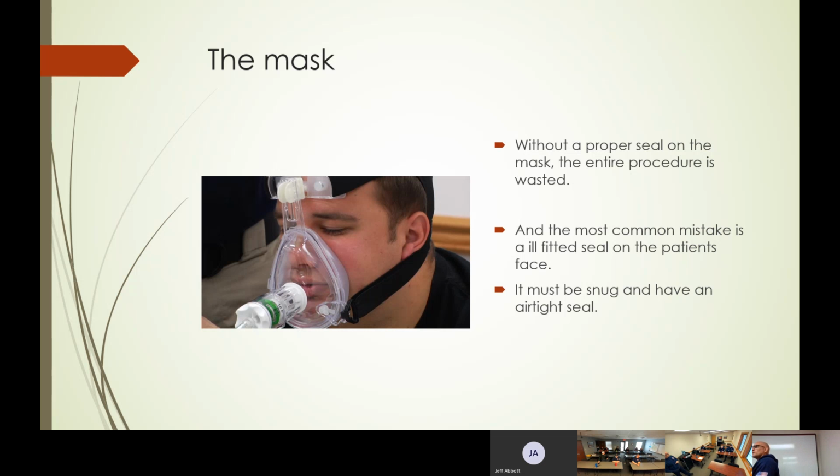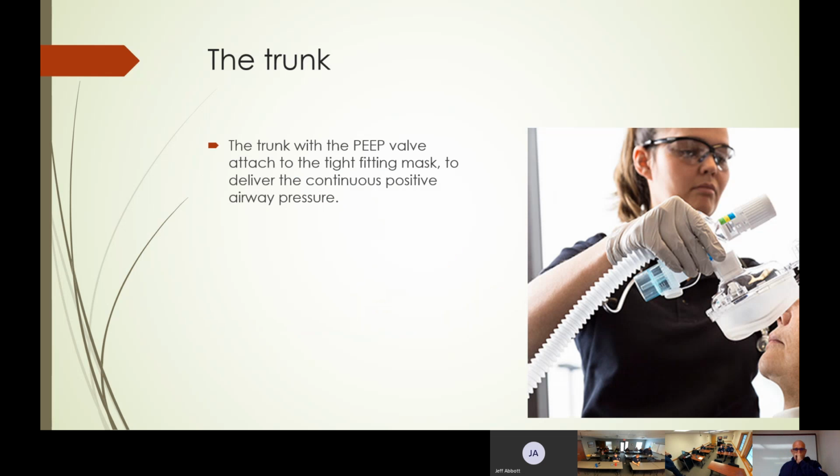What else? Facial hair. Yeah, the Duck Dynasty guys, or whatever. You've got all these big, thick beards. You might not be able to seat it down there. We're not going to shave somebody to get a seal on a CPAP. So there are instances where even if it would be beneficial, if you can't get the seal, it's not going to work. It's a pressurized system, and without that pressure, it's just a waste of time. So just keep that in mind. We need to do our best to try to get it sealed.